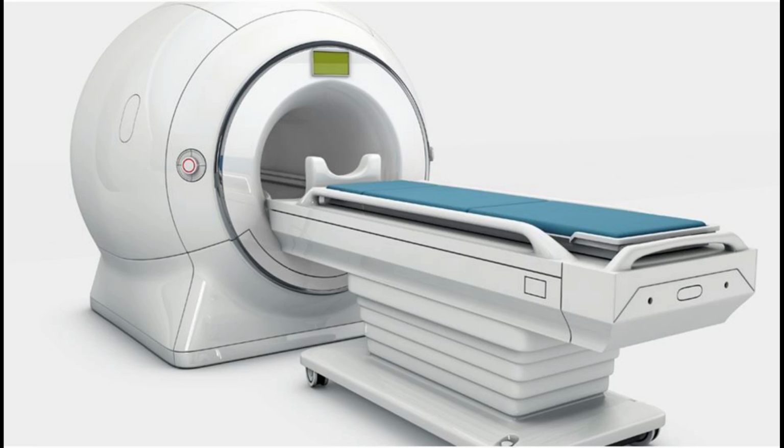MRI has a wide range of applications in medical diagnosis and around 50,000 scanners are estimated to be in use worldwide. MRI affects diagnosis and treatment in many specialties, although the effect on improved health outcomes is disputed in certain cases. MRI is the investigation of choice in the preoperative staging of rectal and prostate cancer and has a role in the diagnosis, staging, and follow-up of other tumors, as well as for determining areas of tissue for sampling in biobanking. MRI is the investigative tool of choice for neurological cancers over CT, as it offers better visualization of the posterior cranial fossa, containing the brainstem and the cerebellum.